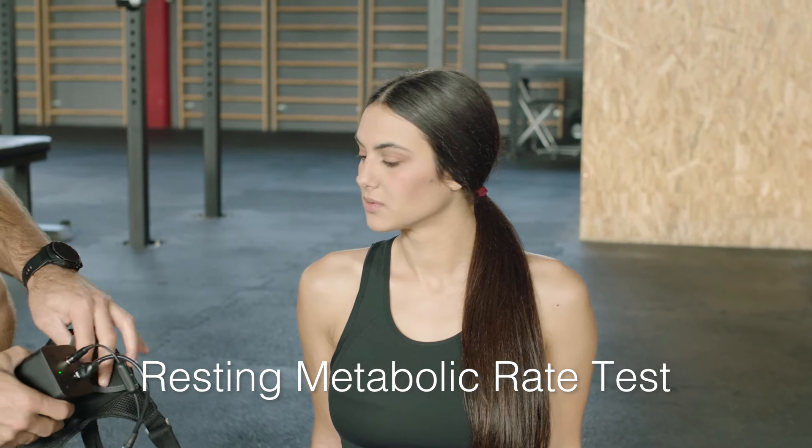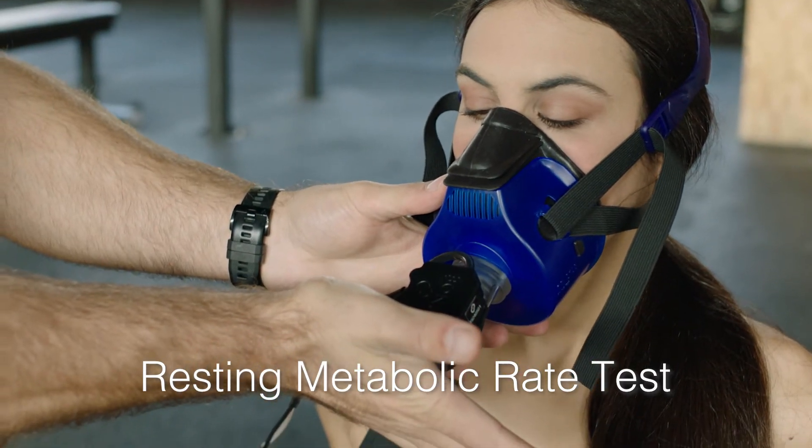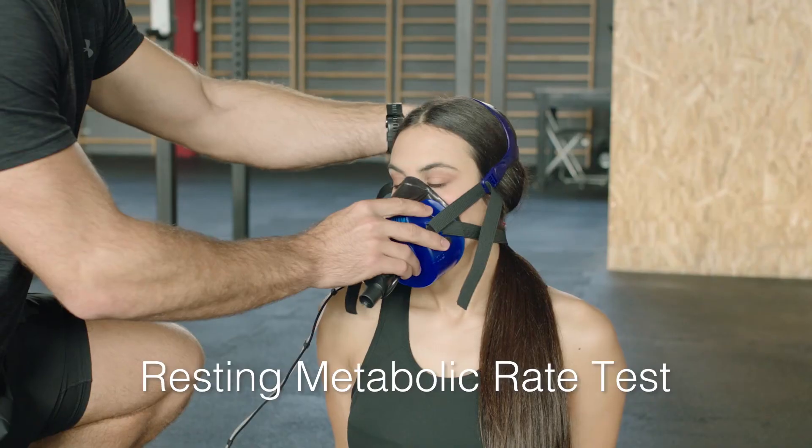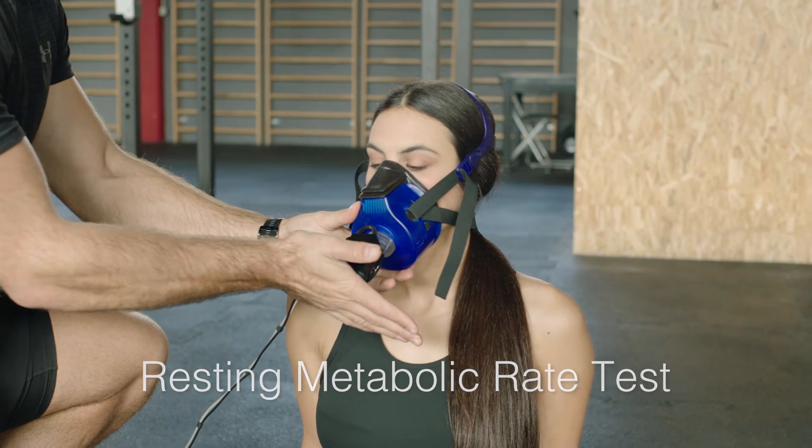Fit the mask to your client. Check if there is leakage by blocking the output of the flow sensor with your hand and ask the client to exhale. To confirm that there is no leakage, there should be no air escaping around the mask.